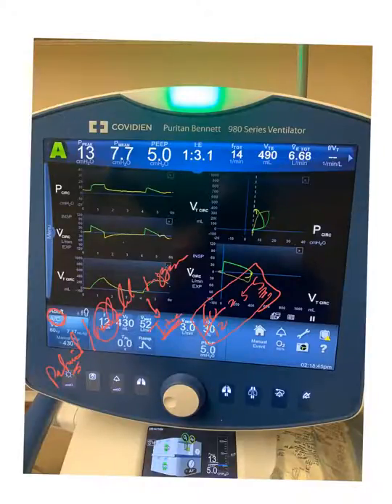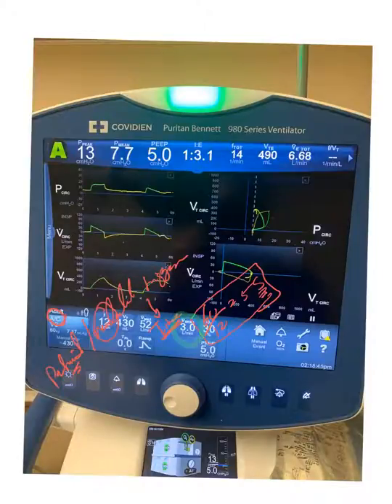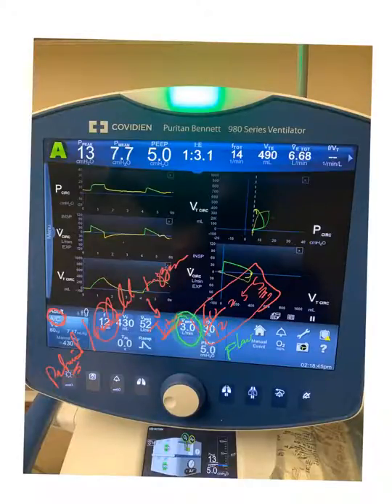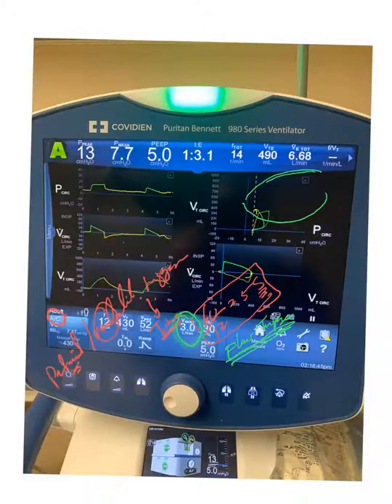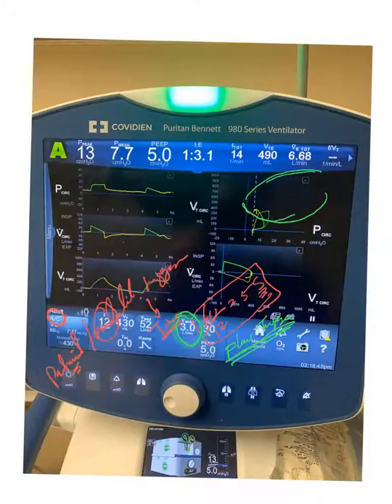If you look right here, this three liters per minute is a flow trigger. Basically, we are telling the ventilator: if there is a difference between the inspiratory and expiratory limb — if the expiratory flow is less by three liters or more compared to the inspiratory limb — go and deliver a breath.